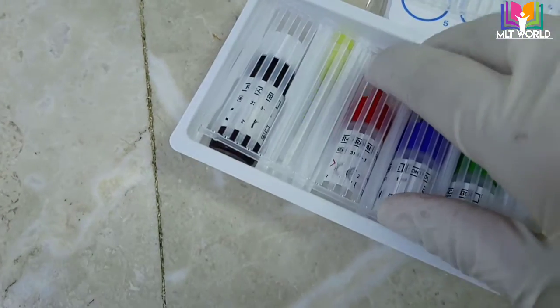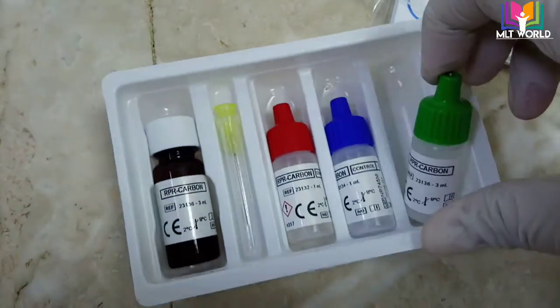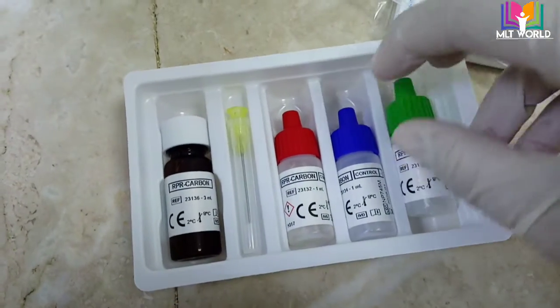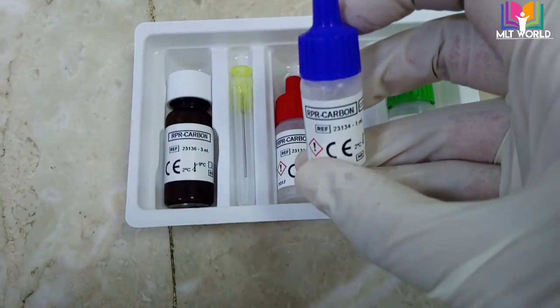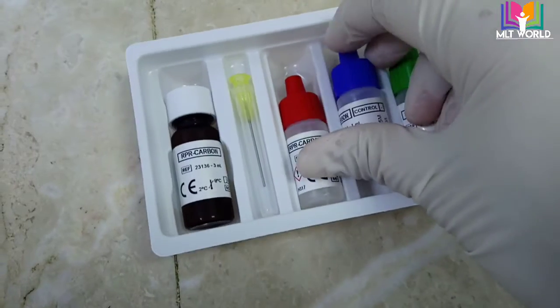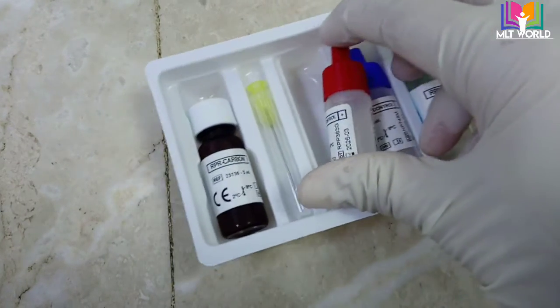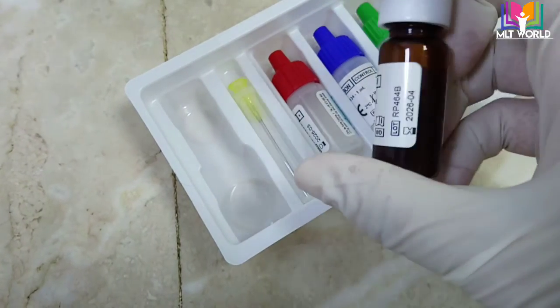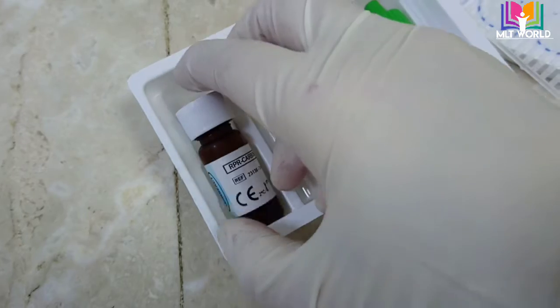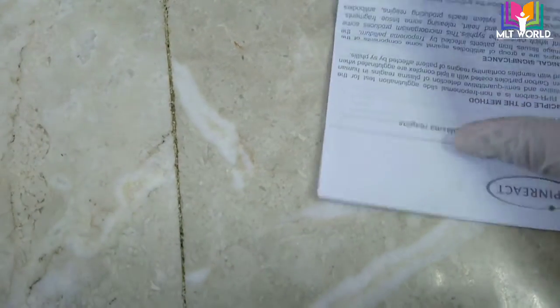When the kit arrives, you have to store it at 2 to 8 degrees centigrade. Before performing the test, keep the kit outside for at least 15 minutes so that the reagents come to room temperature. In the kit you will find a negative control, a positive control, and the RPR carbon reagent. The negative control has a blue color cap and the positive control has a red color cap. The dark bottle color indicates the reagent is sensitive to sunlight and should be kept away from it.